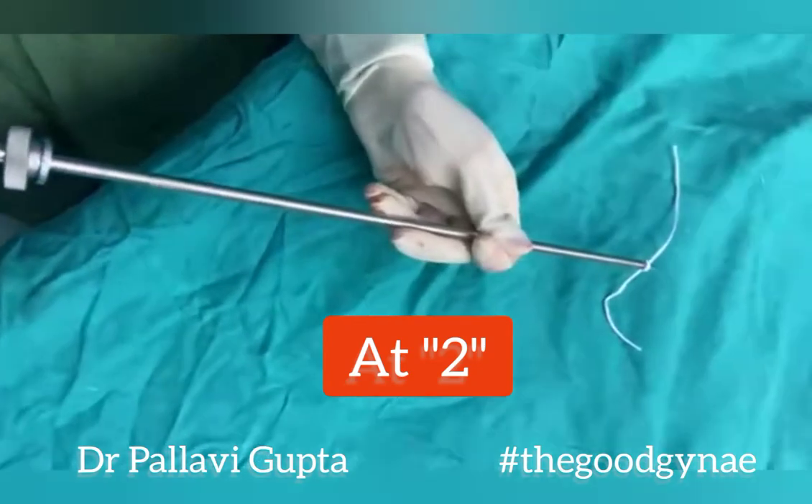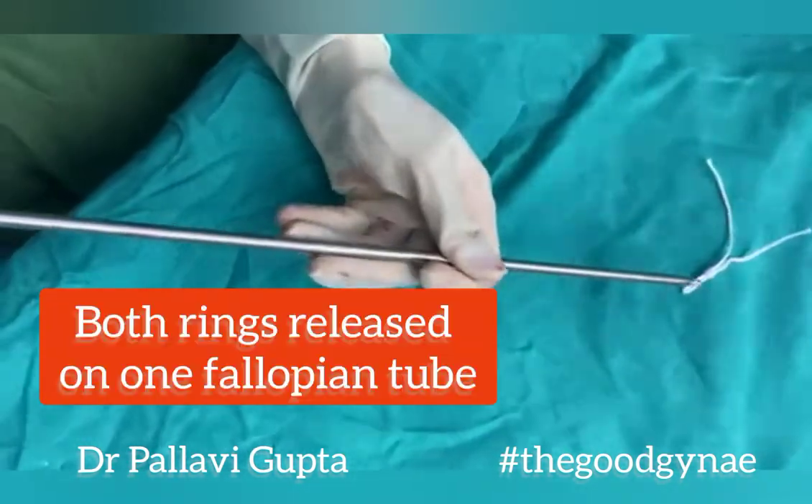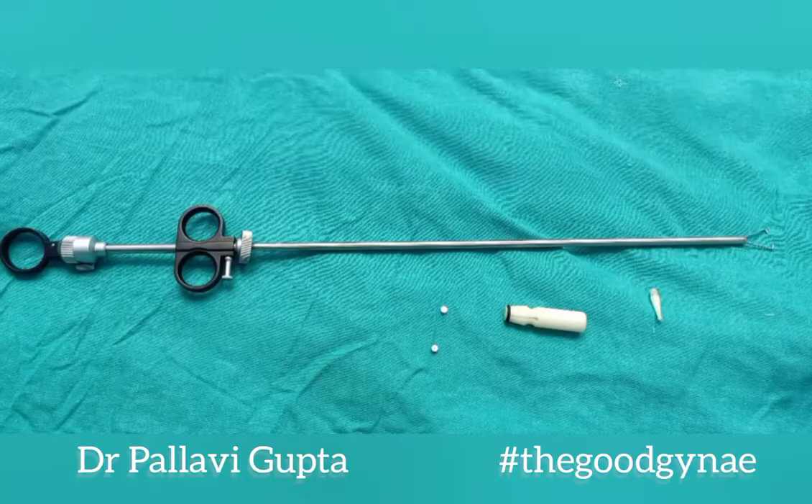With both rings loaded, suppose instead of selecting 1 we select 2 at the ring delivery collar. When we fire, the inner sheath is pulled in completely and both rings are going to be loaded on the same fallopian tube — this is an error to avoid.